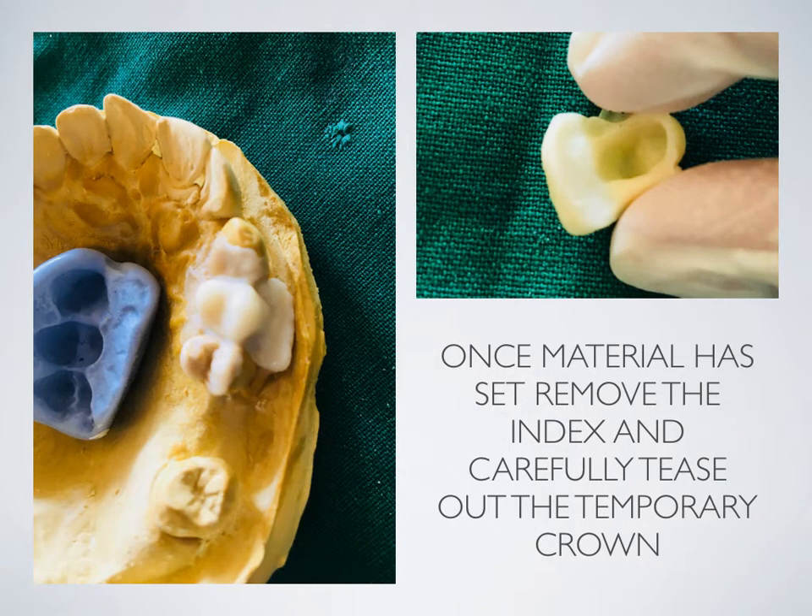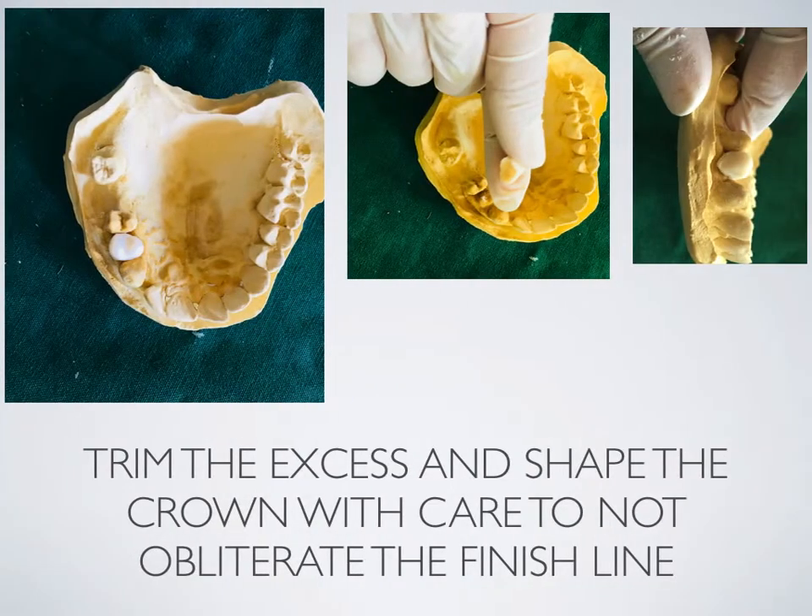Once the material has set, remove the index and carefully tease out the temporary crown so as not to fracture it. Trim the excess and shape the crown with care not to obliterate the finish line.